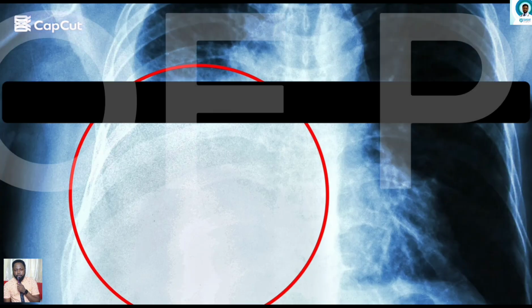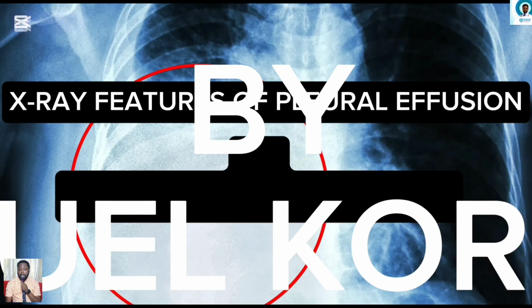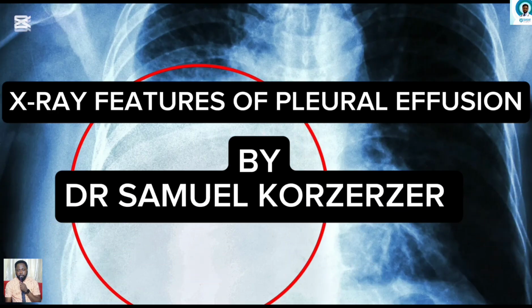Hello again and welcome to this discussion on the chest X-ray features of pleural effusion. This tutorial is a follow-up to our earlier tutorial on the interpretation of chest X-ray, where we had a general overview of chest X-ray interpretation. You may wish to refer to that tutorial to refresh your minds.